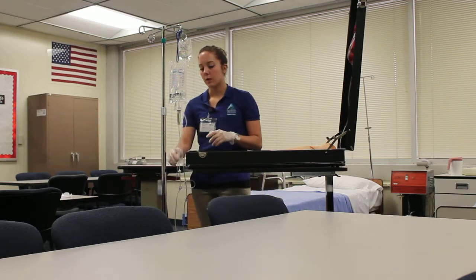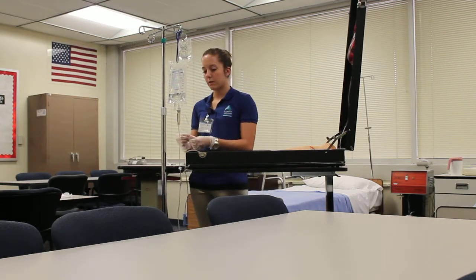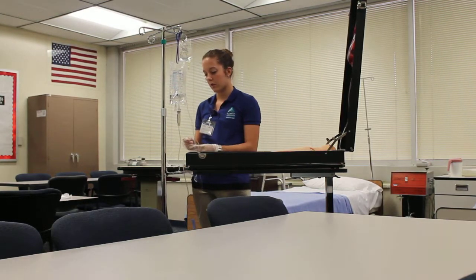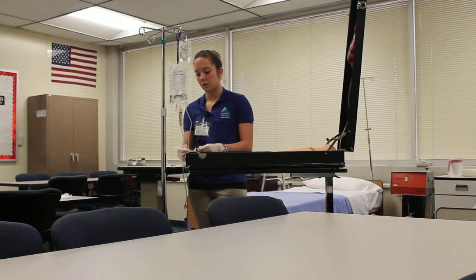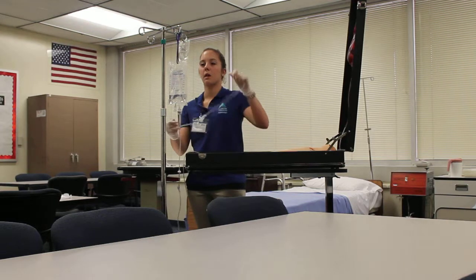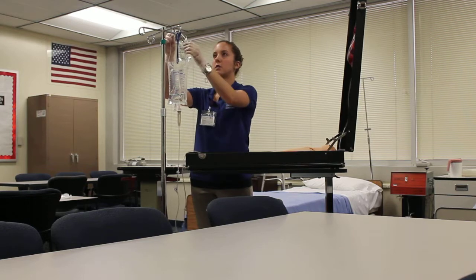Once the medication administration is over, I can come back into the room, perform hand hygiene again, and put on clean gloves. I'm going to check the IV site for phlebitis or infiltration. I'm going to clamp off the piggyback, unclamp my primary, and reestablish the drops per minute. And I would watch my watch for that as well. You can go ahead and unclamp the piggyback. And I would need to get a new alligator clamp for the next med administration.